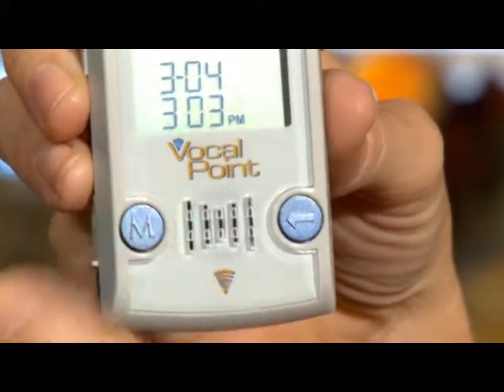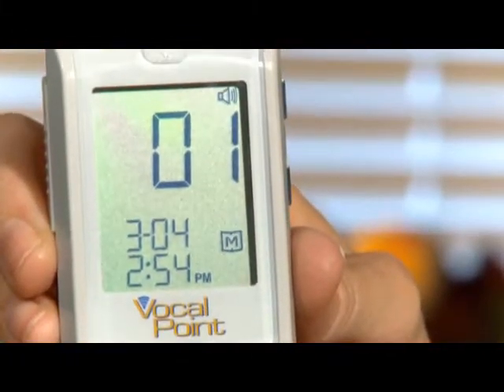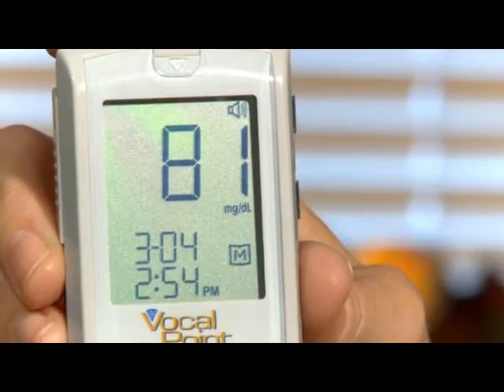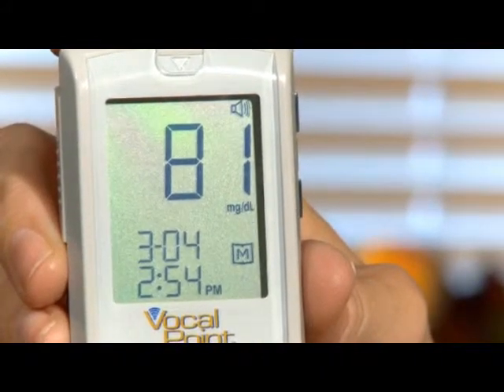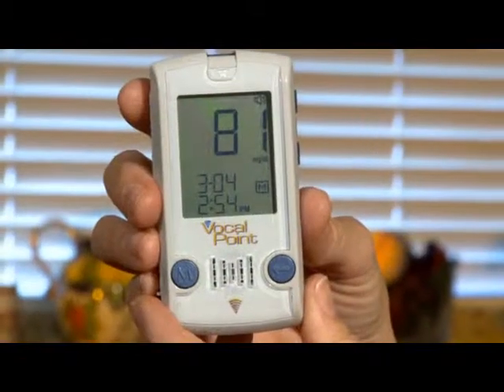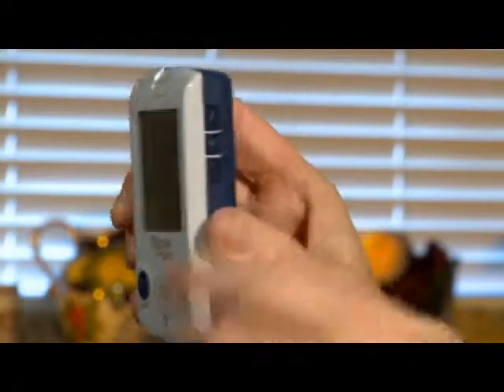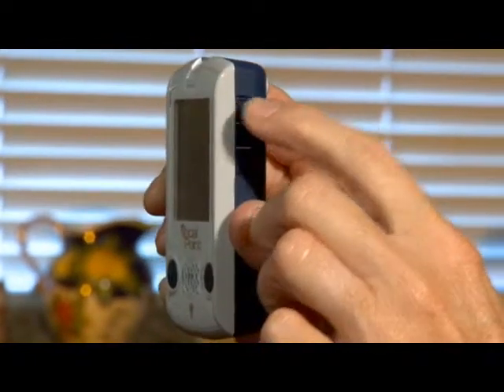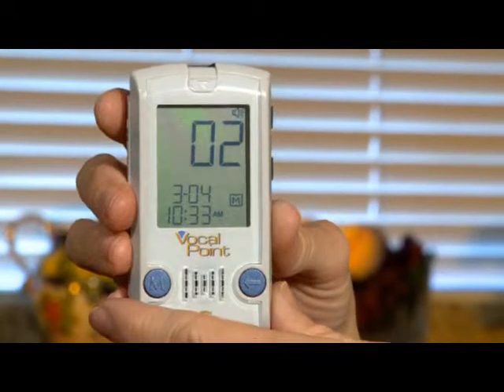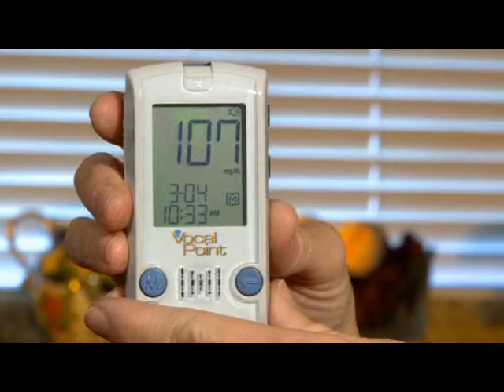When prompted, press the M button to access the memory results. The most recent test, noted as 01, will show the specific date and timestamp that test was run. To retrieve additional results, press the up button one time to display the second most recent test. Keep in mind the Vocal Point meter will store up to 450 test results.